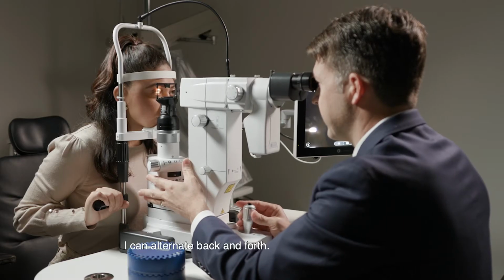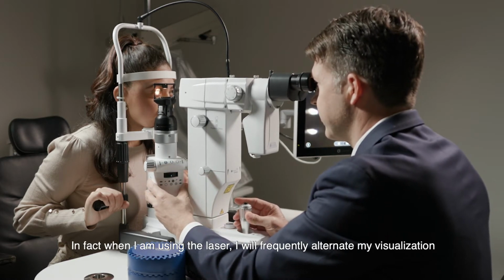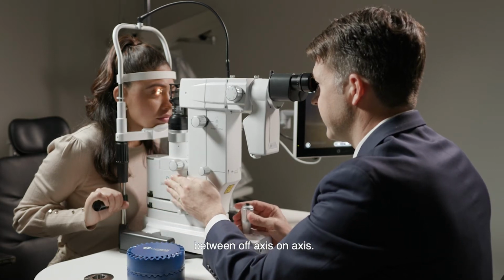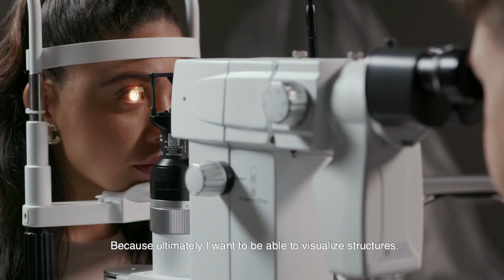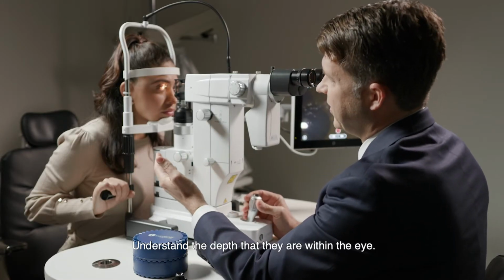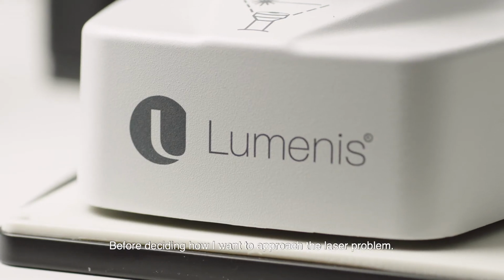I can alternate back and forth, and in fact, when I am using the laser, I will frequently alternate my visualization between off-axis and on-axis because ultimately I want to be able to visualize structures, understand the depth that they are within the eye before deciding how I want to approach the laser problem.